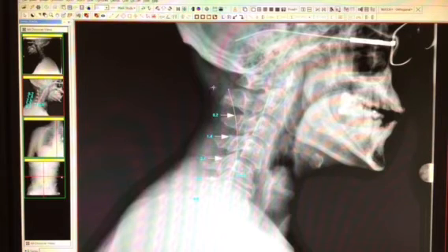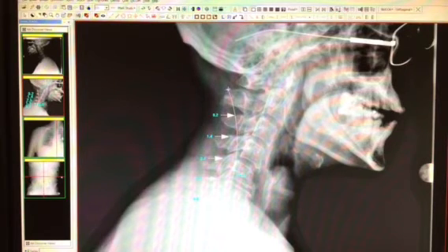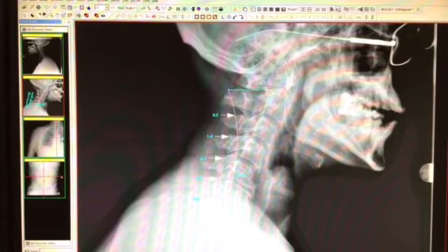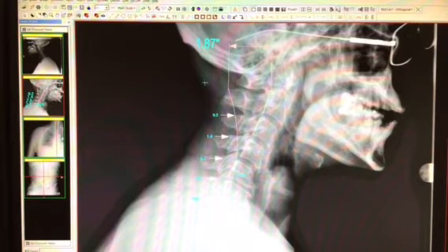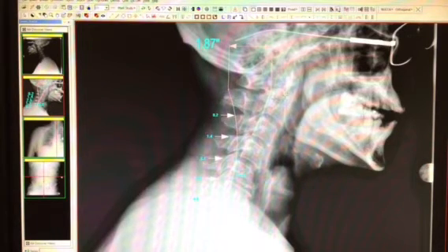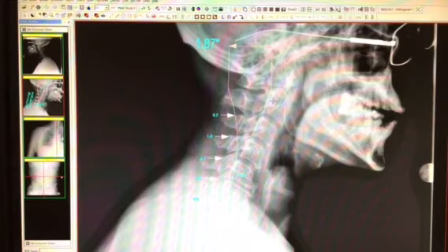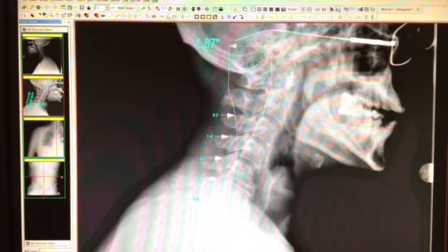We take a measurement from where the center of gravity should be and bring that forward to where it actually is. The measurement shows 1.87 inches forward — that is how far shifted this cervical spine is. Now we're going to calculate the C1 angle.